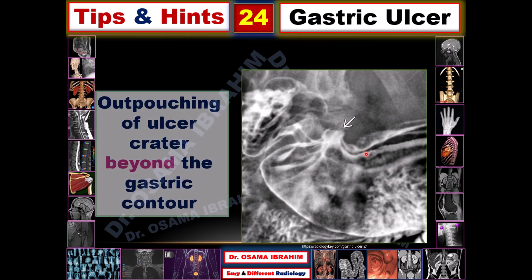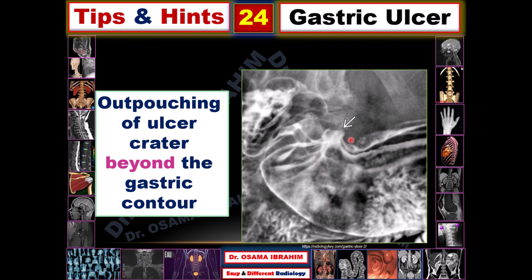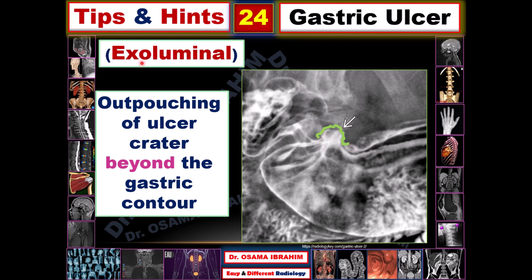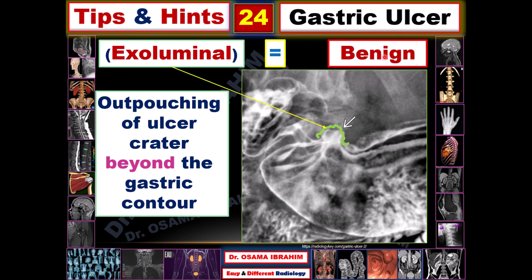Looking at the first criterion: this is a double contrast study of the stomach. This is the lesser curve, this is the greater curve, this region is the angular incisura, and this is the pylorus. This ulcer is appearing as an outpouching of the crater beyond the gastric contour — if you trace the gastric contour like this, the ulcer crater projects beyond it. This extraluminal location of the ulcer is a feature of benign gastric ulcer.